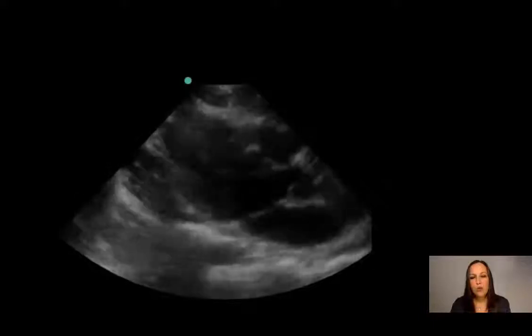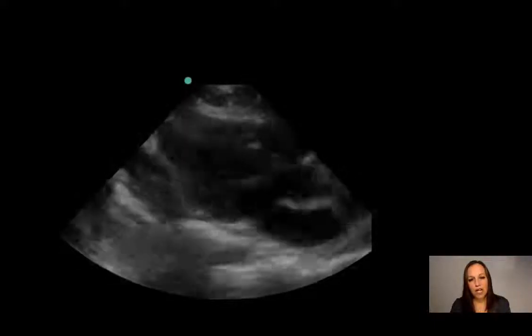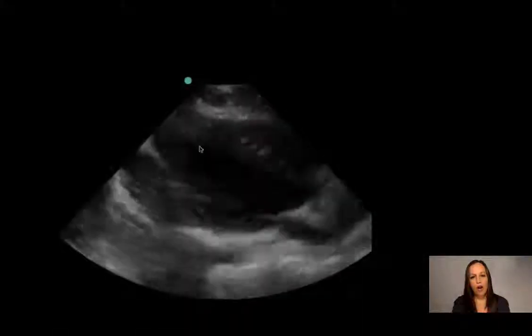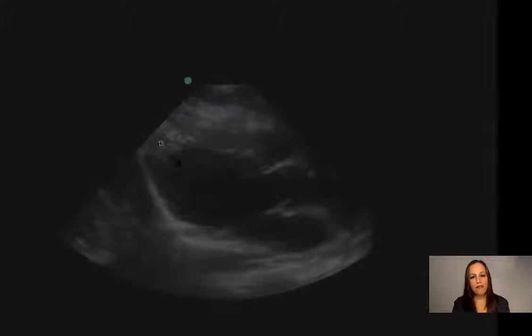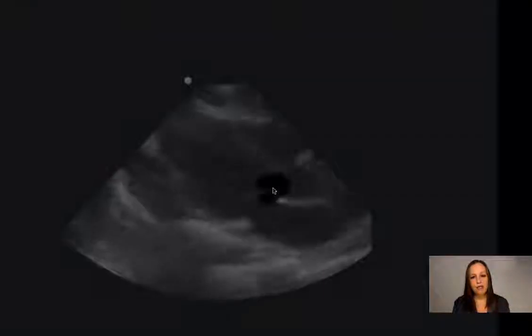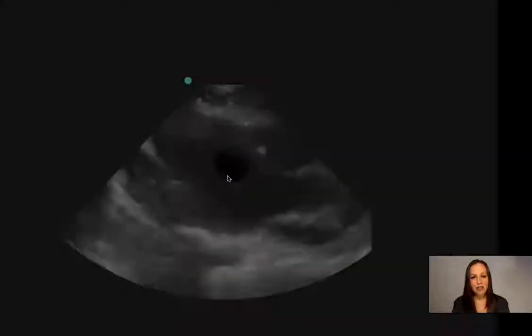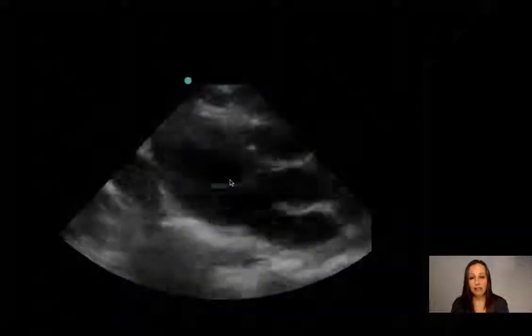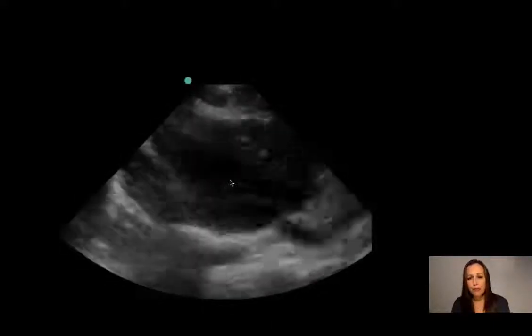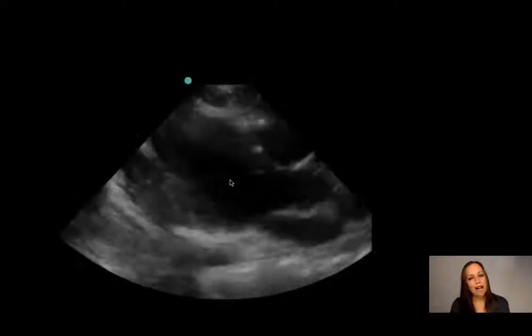So now if you ignore the actual rate itself, that was our first question. We already know it's hyperkinetic. Then we're going to focus on the contractility itself. Now, our question: is the posterior wall of the left ventricle thickening? Yes. Is the anterior leaflet of the mitral valve moving towards the septum? Yes. And is there change of the cavity of that left ventricle? Also yes. So this is actually pretty good squeeze, pretty good contractility, but it's often confounded by the fact that it's hyperkinetic.